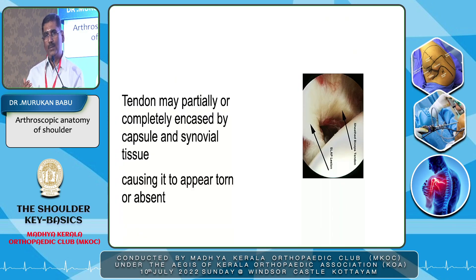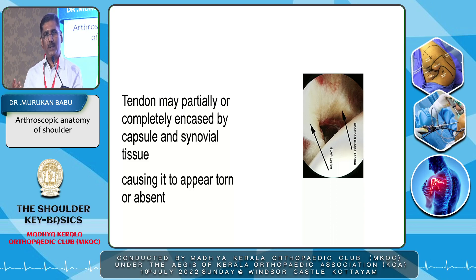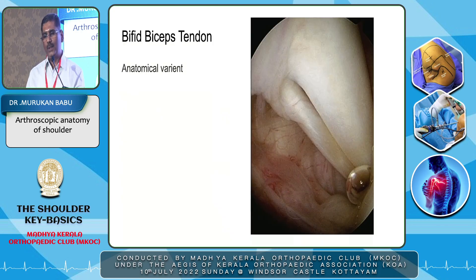Sometimes the biceps tendon may be completely or partially encased by capsule and synovial tissue, and you may not be able to see the biceps tendon at all. You may think that the biceps tendon is absent, but it is covered by synovium — and you should know that this is a normal anatomical variant. Sometimes you can see a bifid biceps tendon, which is also an anatomical variant.